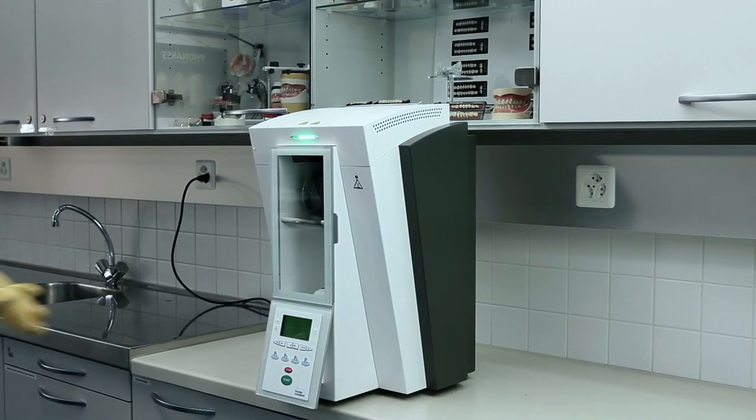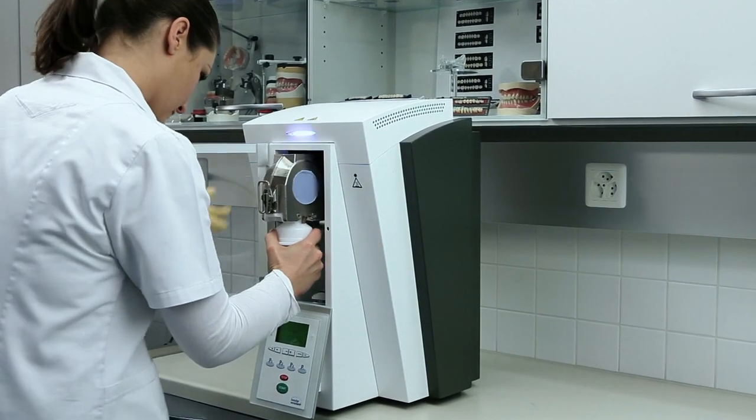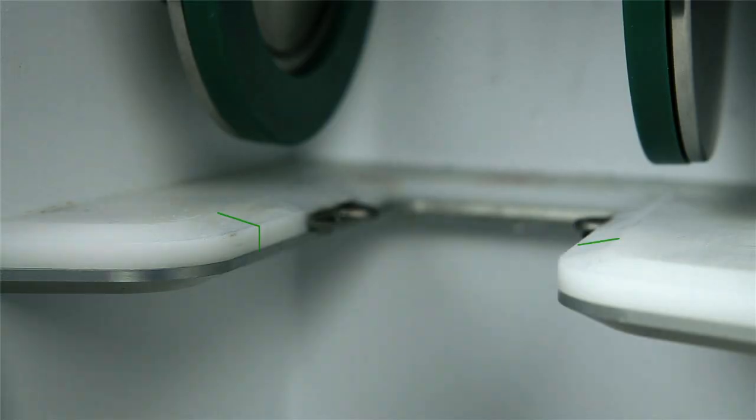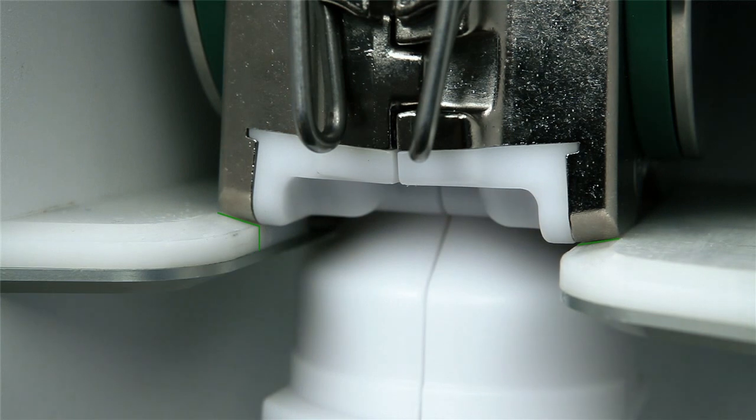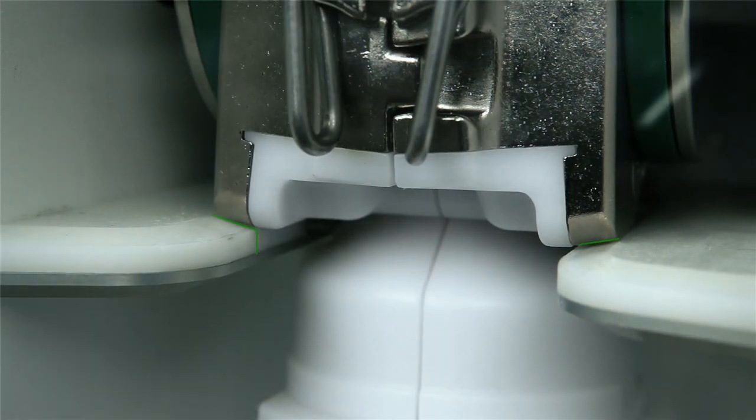Slide the flask with the capsule into the polymerization chamber until it stops via the flask holder. The flask perceptibly snapping into place indicates the correct position.